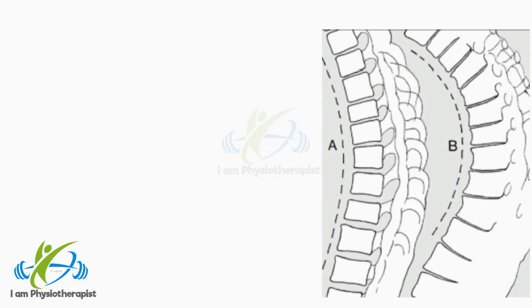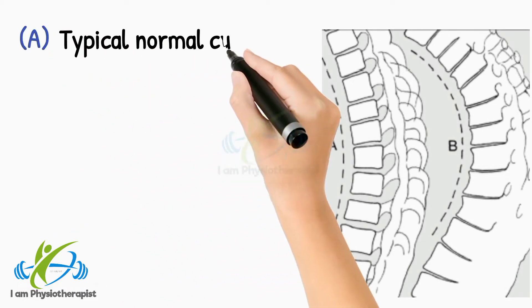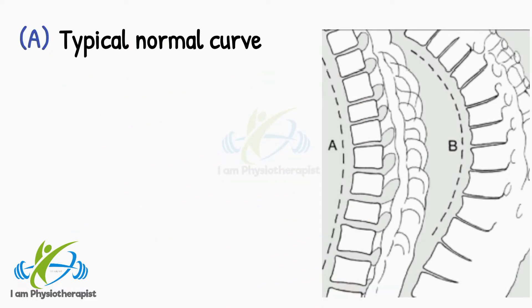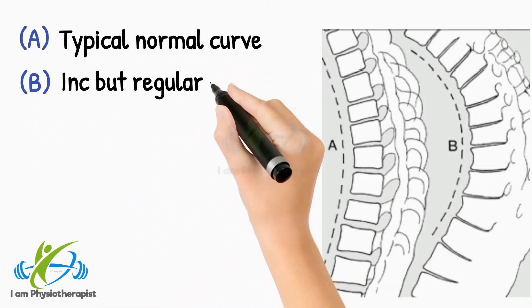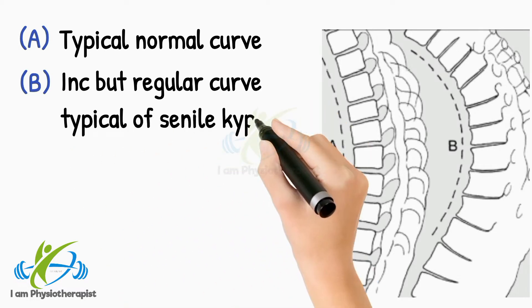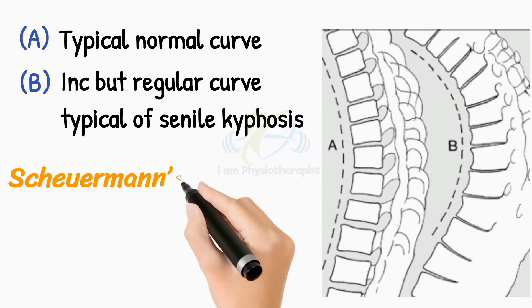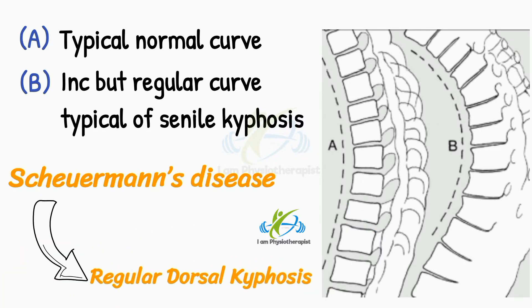Note curvatures in the thoracic spine. Point A shows a typical normal curve, and point B shows an increased but regular curve typical of senile kyphosis. Scheuermann's disease is another frequent cause of a regular dorsal kyphosis.